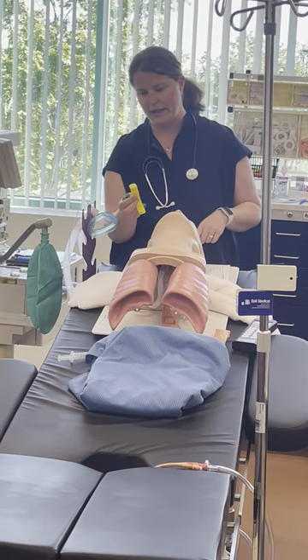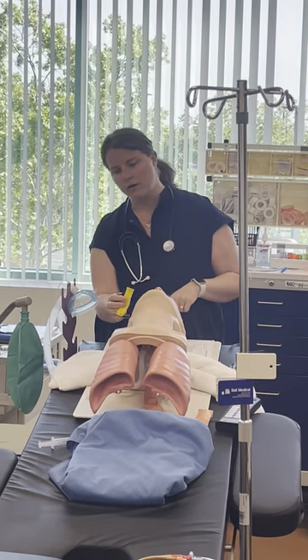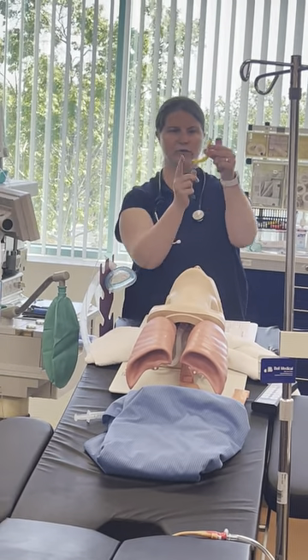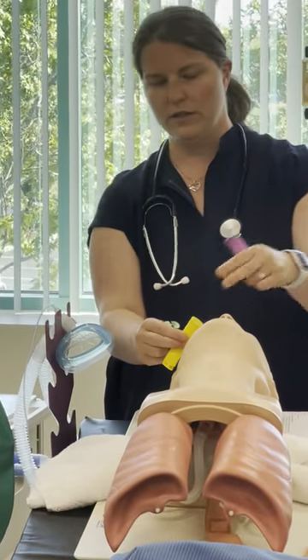To measure OPA size: the flange — this flat part on top — goes to the corner of the mouth, and then the tip of the OPA should reach to the earlobe.